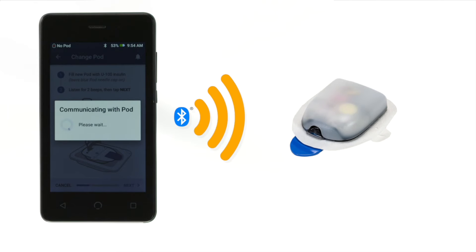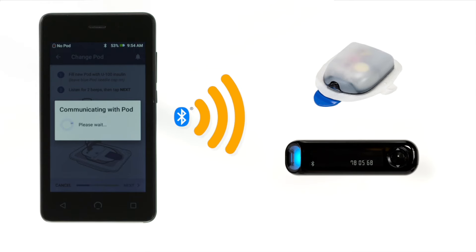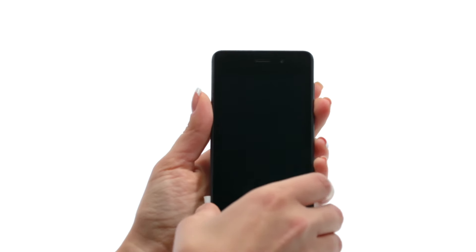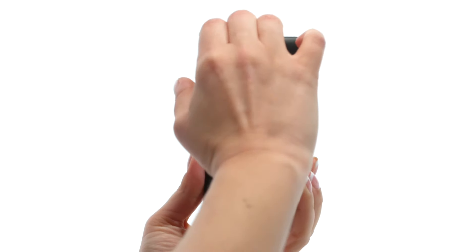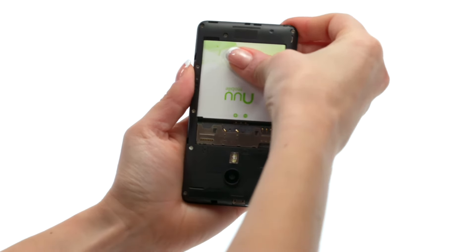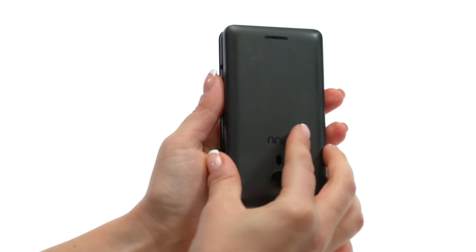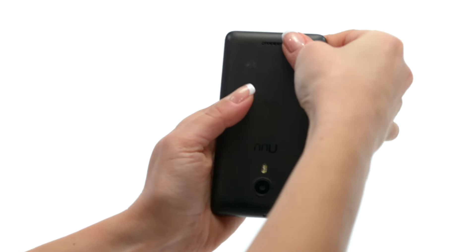The PDM uses Bluetooth technology to communicate with the Dash pod, as well as the Contour Next One BG meter. To set up the PDM, first insert the battery included in the starter kit. Turn the PDM over and use the attached pull tab to remove the PDM's back cover. Insert the new battery. To turn on the PDM, press and hold the lower, smaller of the two buttons on the side of the PDM.